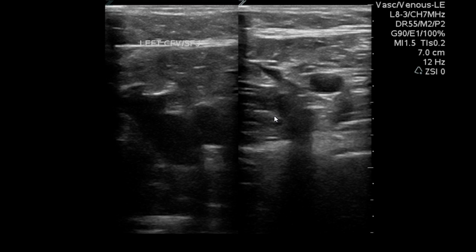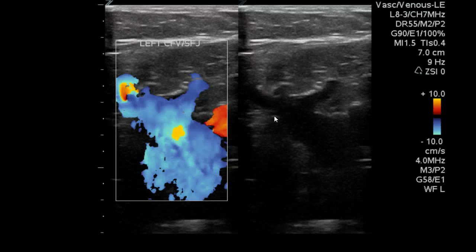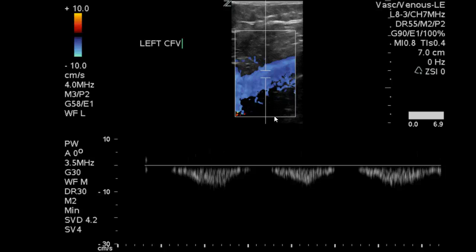As with any unilateral exam, the sonographer moves to the contralateral common femoral-sapheno-femoral junction to prove patency. We've taken a compression picture here with color to show patency and a spectral Doppler waveform.